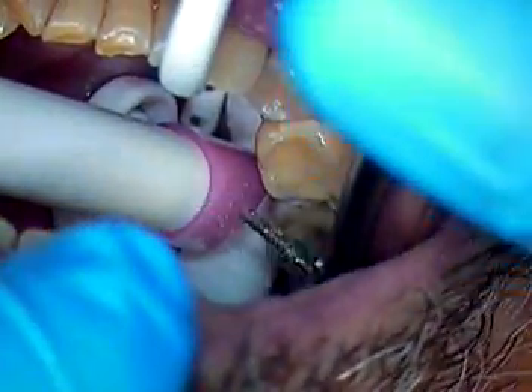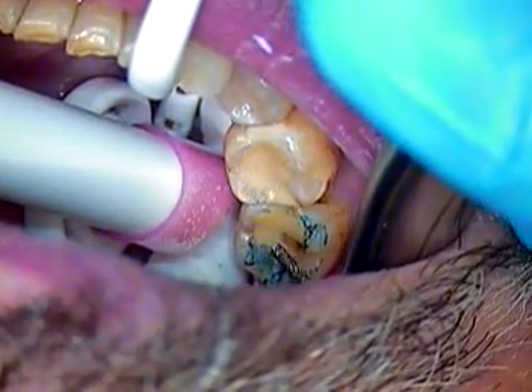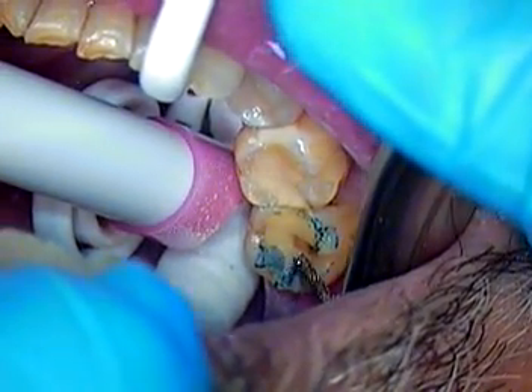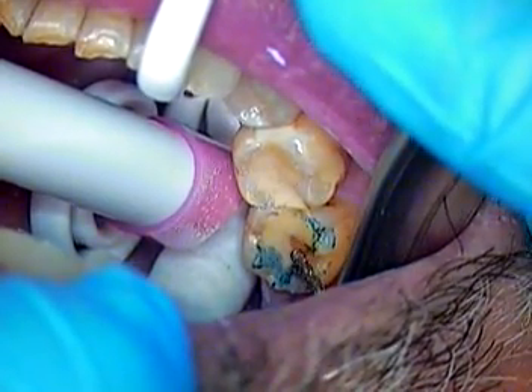Hello and welcome. This is Dr. Jerry Cuomo. I'm filming live here in my private office in Boca Raton, and we're doing tooth number 31 on our patient. We're prepping for an Emax, which is a lithium disilicate restoration.